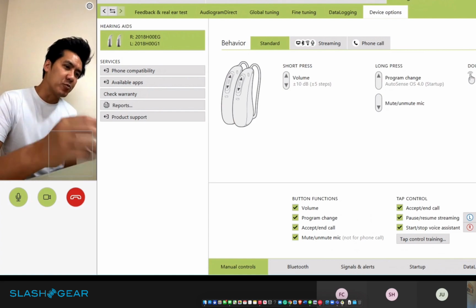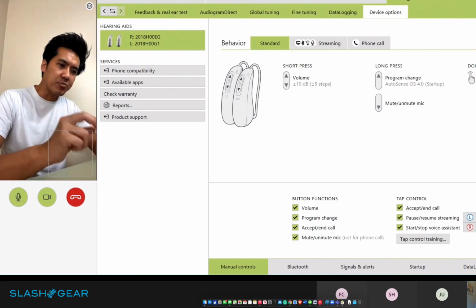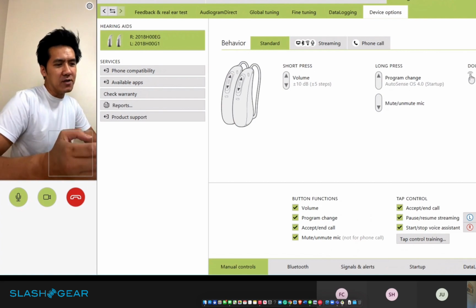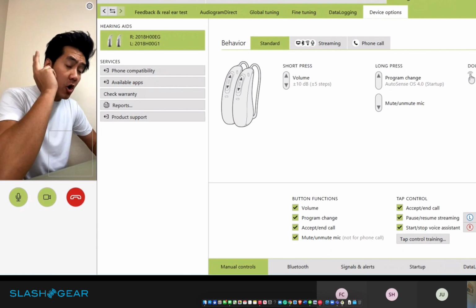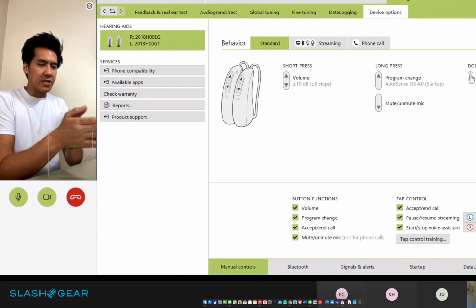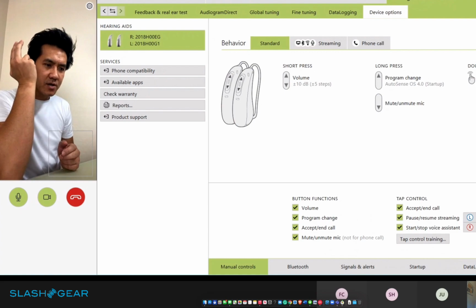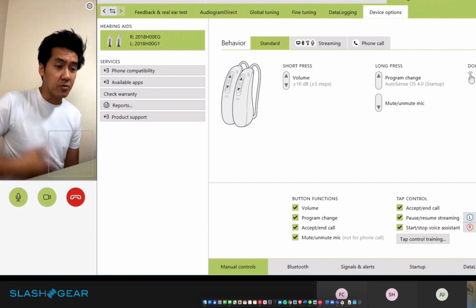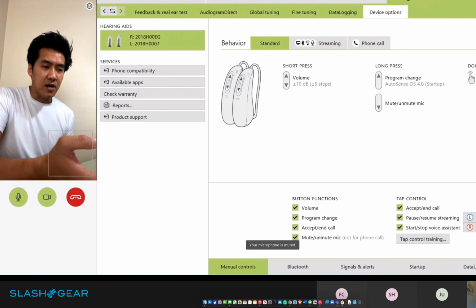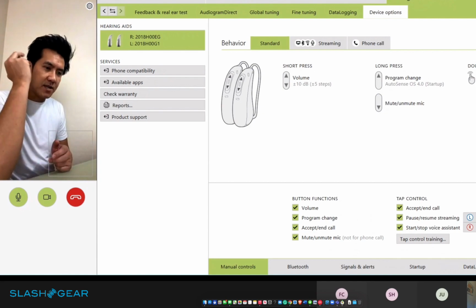For example, Apple's trackpad, right? You can adjust the feedback on how hard you press or tap. I would love it if in the next version you can kind of control how hard or how light you tap, because it varies, right? If you have a low, medium, and high tap, because sometimes if you tap too softly, it doesn't work. So if that's something the team can do, that would be great to allow you, the healthcare provider, to adjust that in the fitting, like how hard I tap.